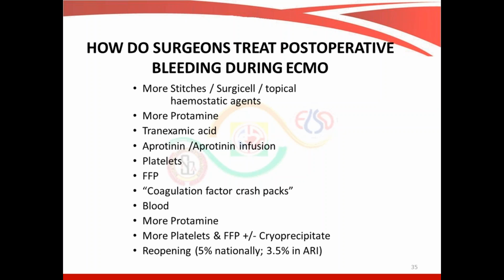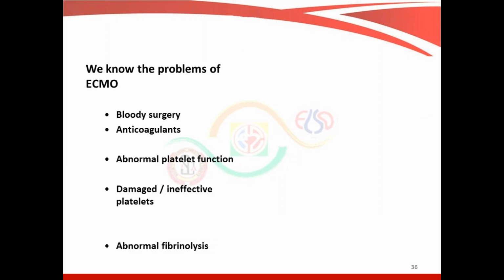So once something like that happens, we know that with ECMO something like this will come up. It is important to buy an ECMO machine and buy a point of care testing machine. Your Sonoclot costs 6 lakhs. Your TEG machine is there for something like 14 to 15 lakhs. And your Rotem comes for 25 lakhs.